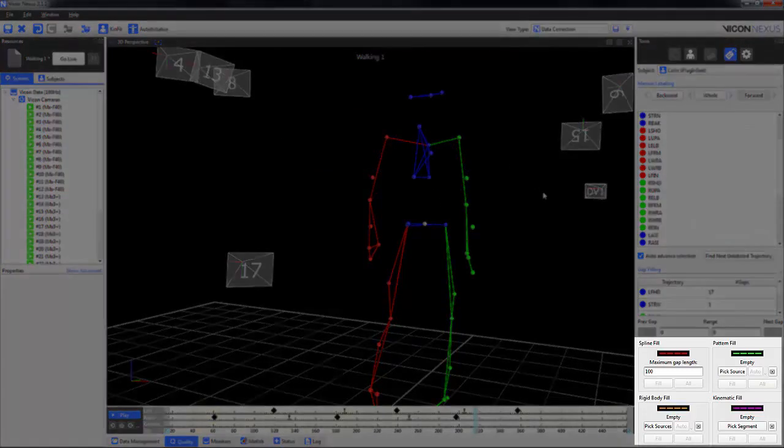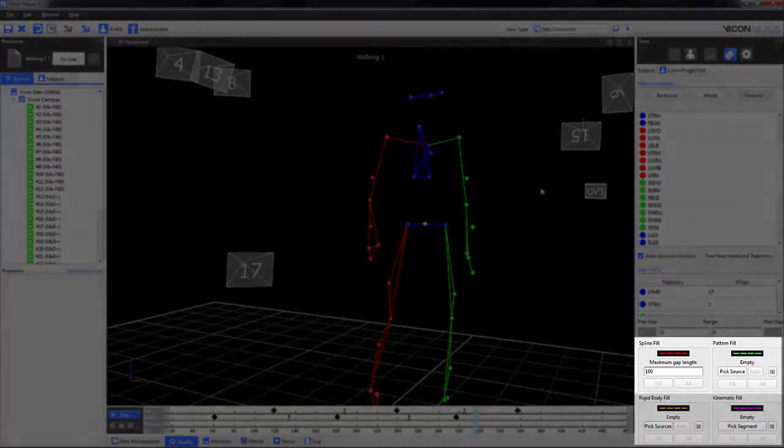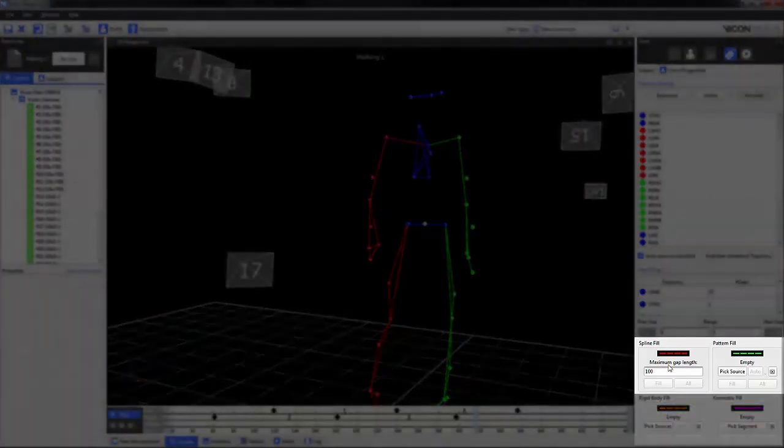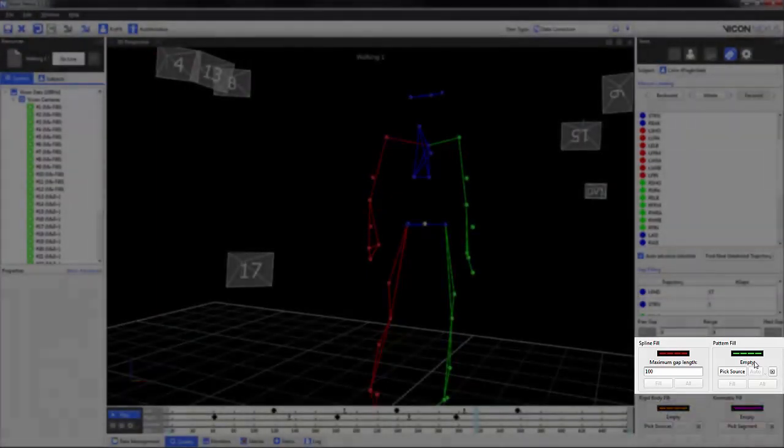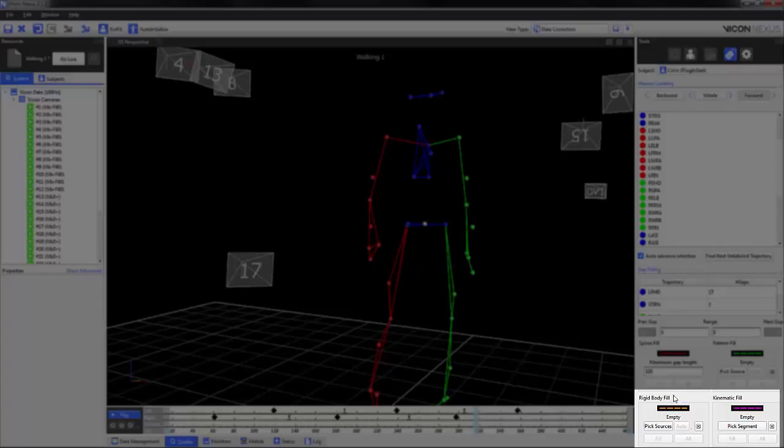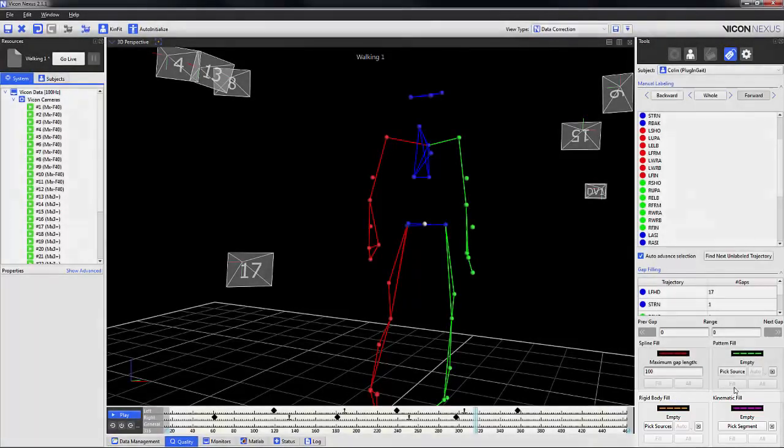We also have the gap filling options. We still have the spline and pattern fill options from Nexus 1, but we also have the rigid body and kinematic fill, which is new to Nexus 2. I'll talk about these in greater detail later.